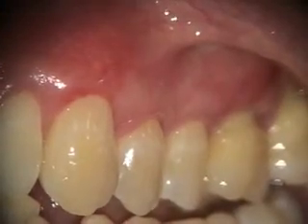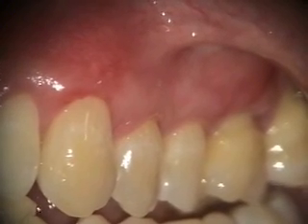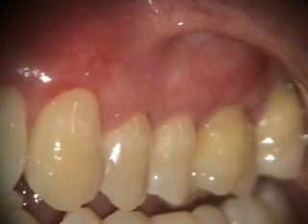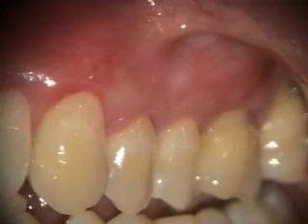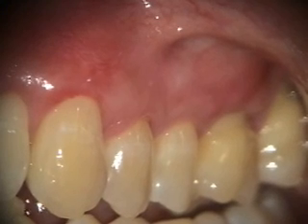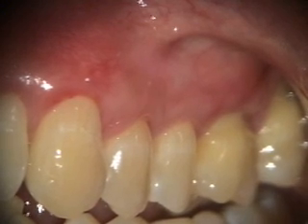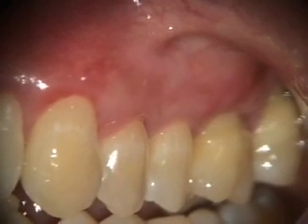Here's a one-month healing of the grafting on the upper left segment, 11-14. It's got good root coverage, and there's a little marginal gingivitis on number 11 — we'll get them to do more circular brushing. Normally I'll have patients just brush coronally from the gingiva at first. We're going to take a look at this in another couple months.